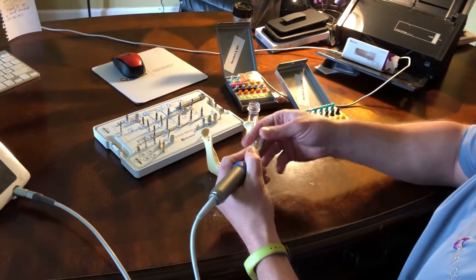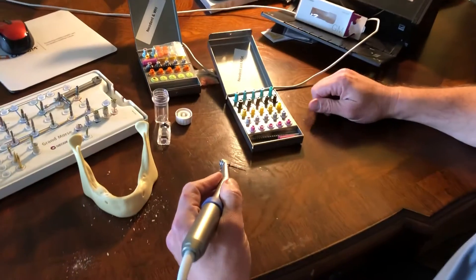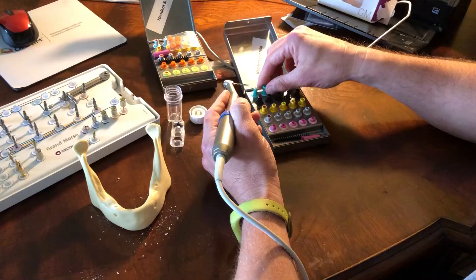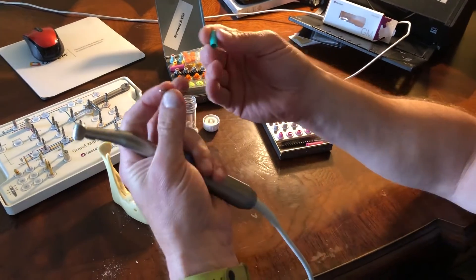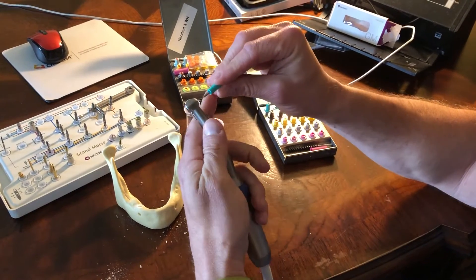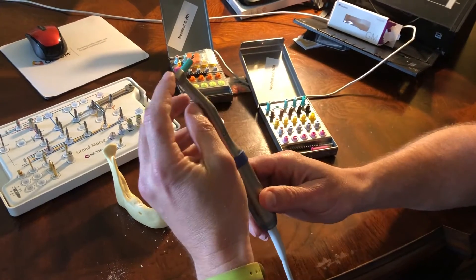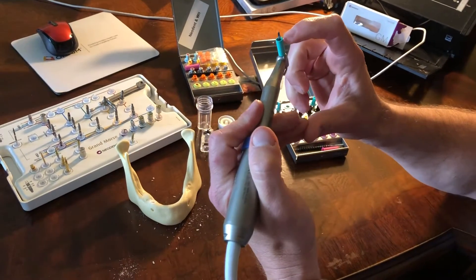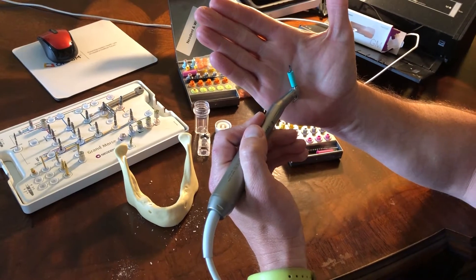So instead we can use our drill stops, customized by Zasio. We simply take one of these out — this happens to be the 8 — slide the drill up through the bottom, connect it, and make sure that's locked in. I did verify all of these — that's for the 8 length.